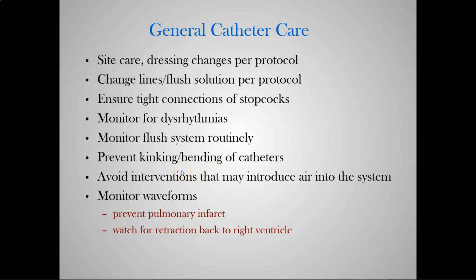Absolutely. And now, there's this misconception that like, oh my God, hey, look, an air bubble, you're going to die. That's not the case. It would take roughly about, in most patients, not all, a continuous stream of about 8 to 15 mLs minimum to create cardiac disturbance. That's a lot. It's like taking a flush and just slamming it. I am not telling you to test this. I'm not telling you to go do that. And yes, there have been cases where it took less than 8 mLs to create a PE, an air embolus.